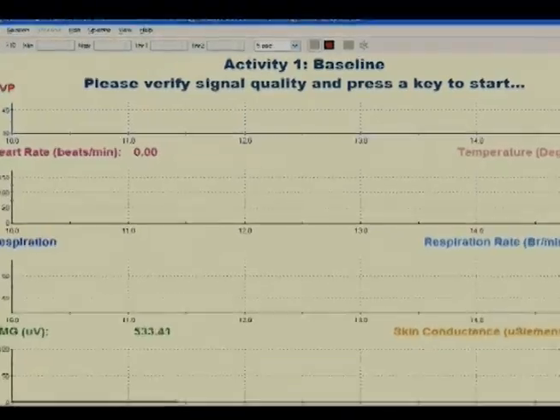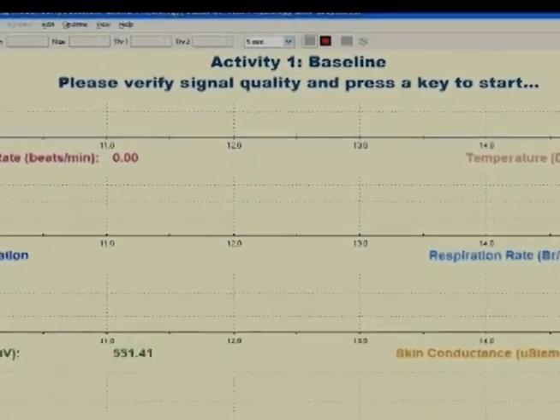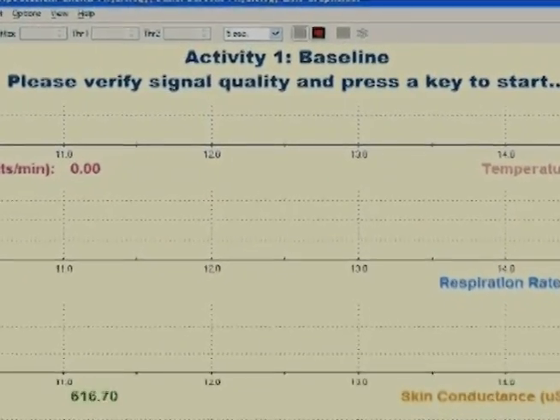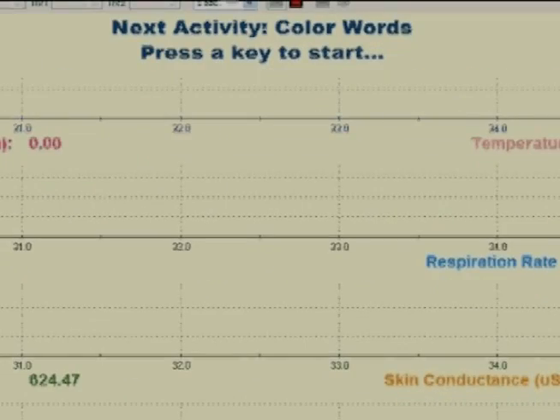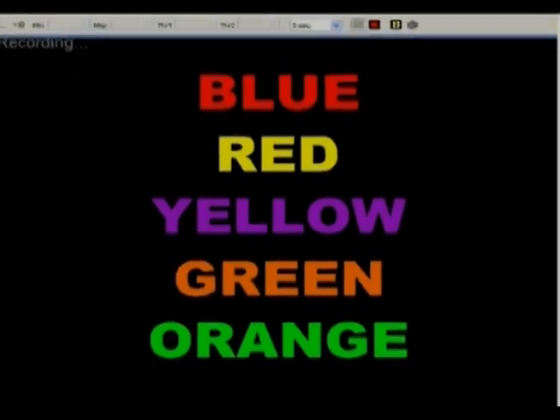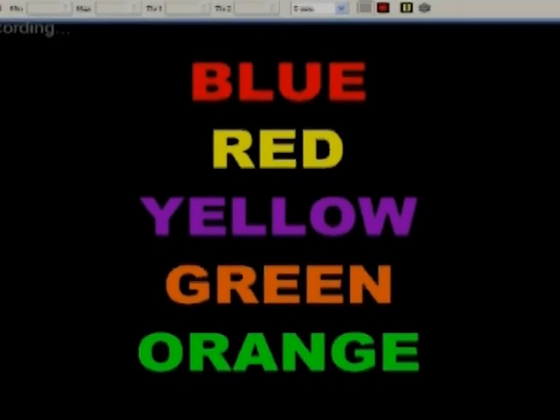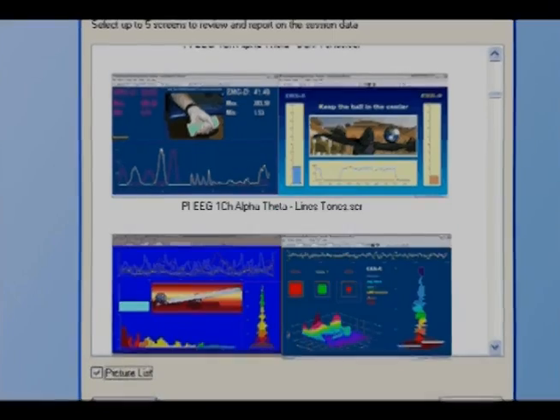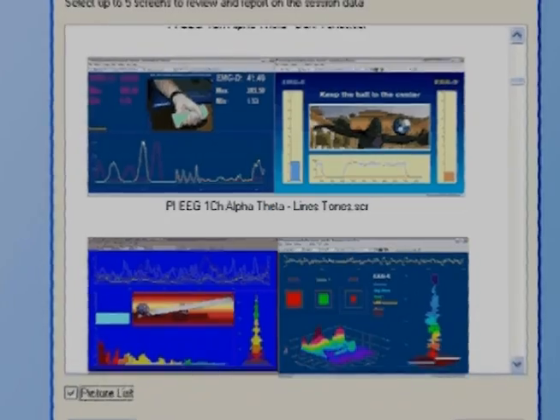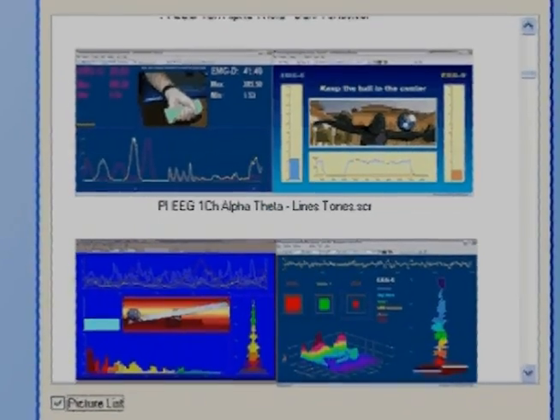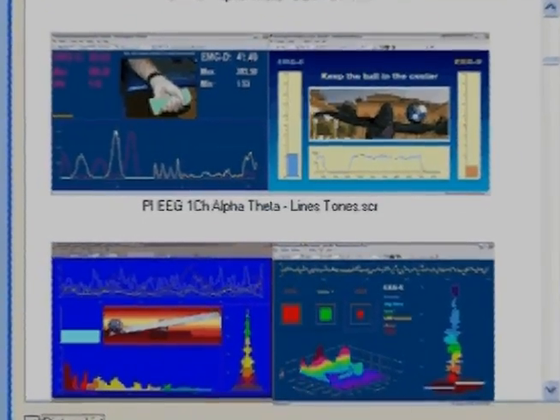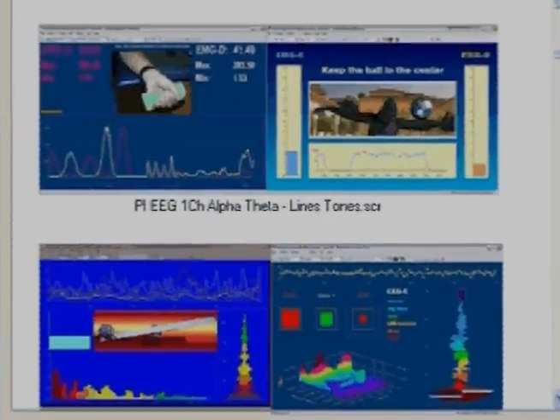Customizable scripted sessions are also available to have your clients follow steps and instructions in a predefined sequence, ideal for work, rest applications, and stress profiling. Looking for your favorite screen but cannot remember the name? Simply click on View Image and get a thumbnail view of the screen.